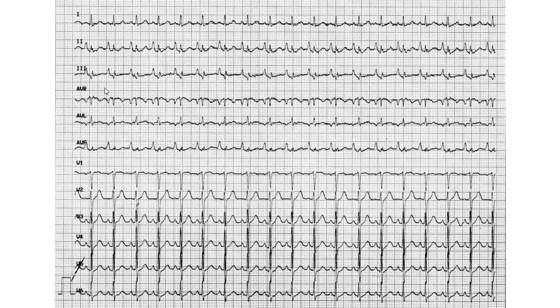Don't disregard the 3rd point. You give all the points their proper due, and you mark the pathologies where they are. It's got to be done. So that's point 1, 2, 3. Point 4, you describe the P wave. You say its height and its width.